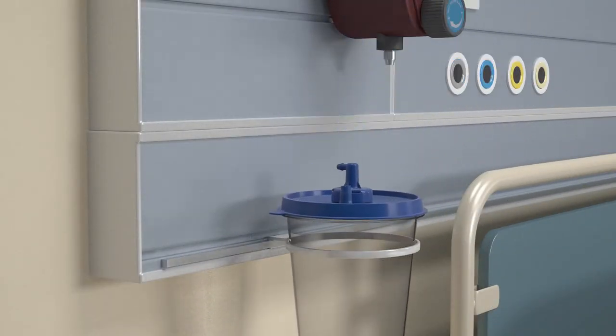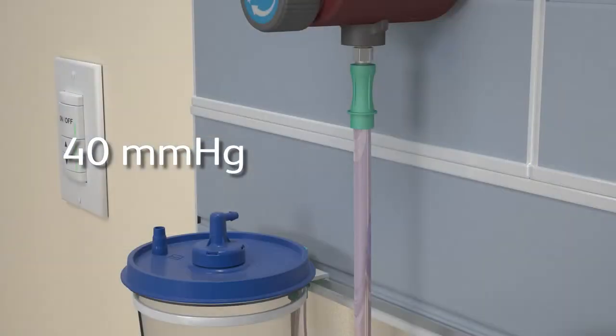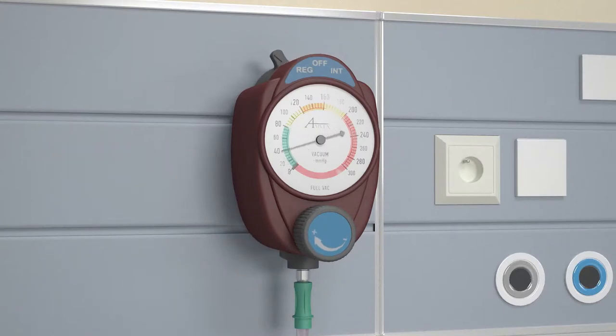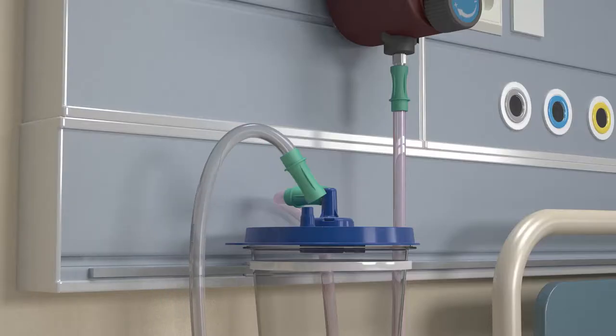Connect a canister to wall suction and set to a minimum of 40 millimeters of mercury continuous suction. Always use the minimum amount of suction necessary. Using standard suction tubing, connect the device to a collection canister.